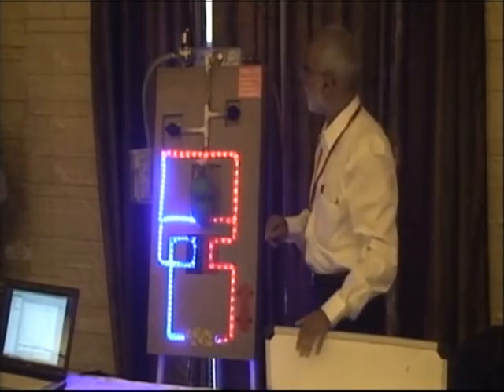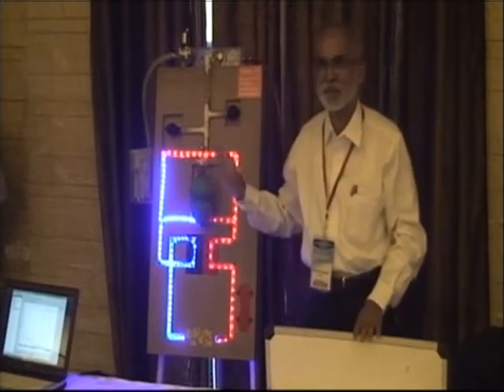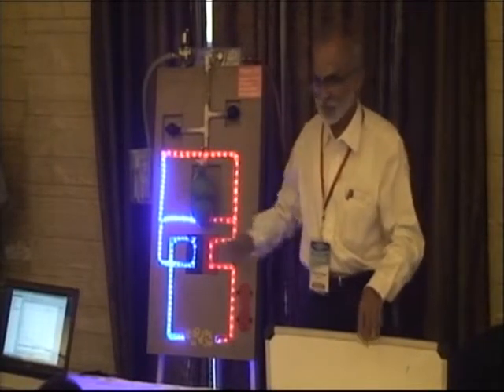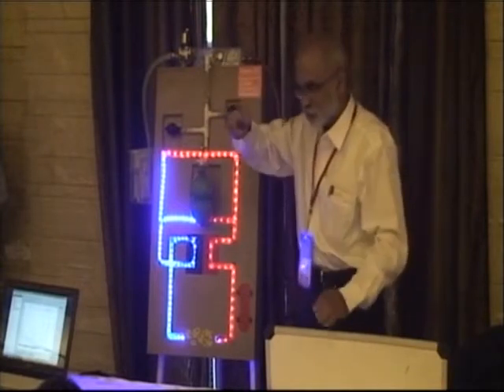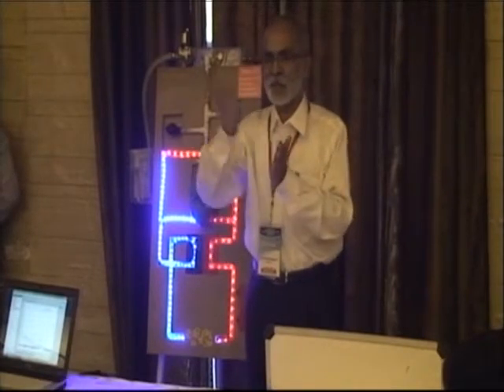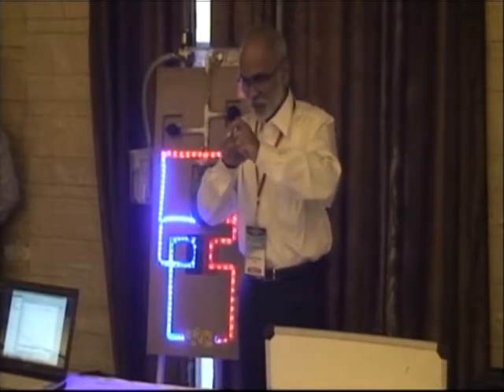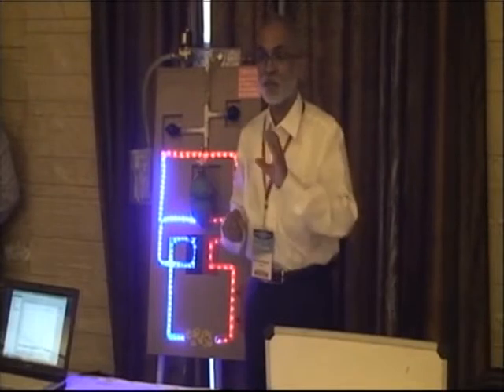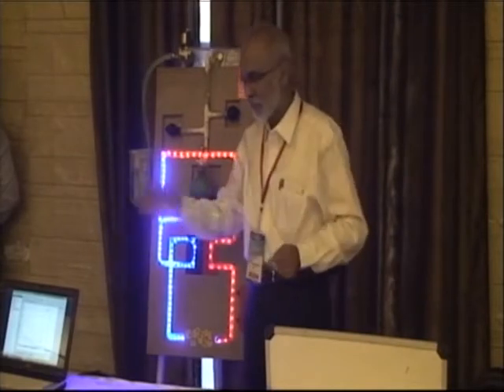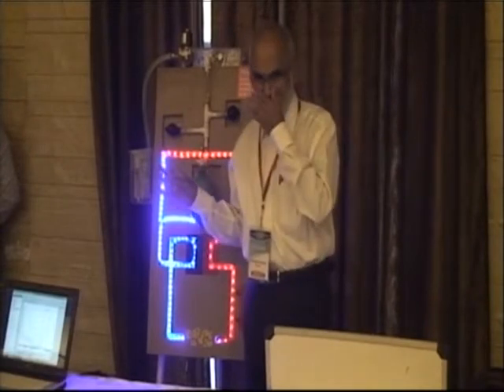In fact, the way the fan moves, we are using nitrogen here for some technical reasons, and nitrogen is not easily available. We're just conserving on the gas. So the way it moves can tell me, it's easy to have a barometric pressure. We have these small little meters on the usual old ventilators. They can be used for measuring pressures. It's not easy to have a flow. This fan speed can give me what level of flow I can even measure on my laptop by a sensor. So these are certain things which are developed on this.